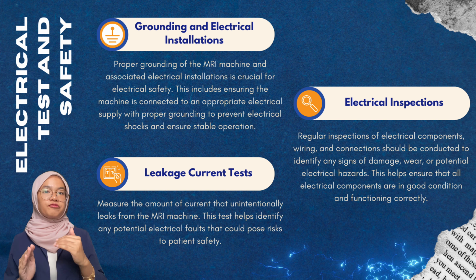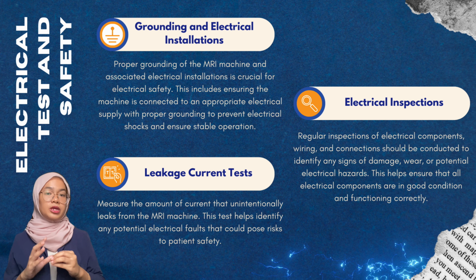Next, leakage current tests are performed to measure the amount of current that unintentionally leaks from the MRI machine. This test helps identify any potential electrical faults that could pose risk to patient safety.